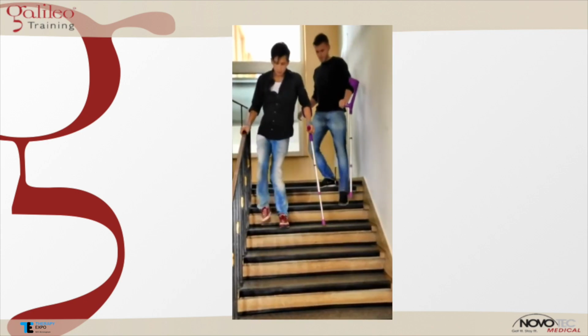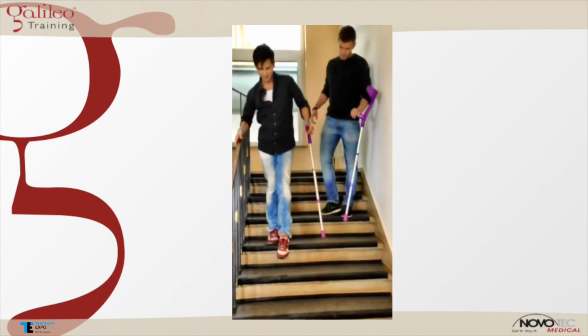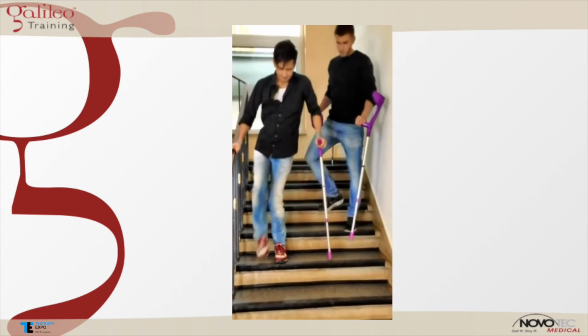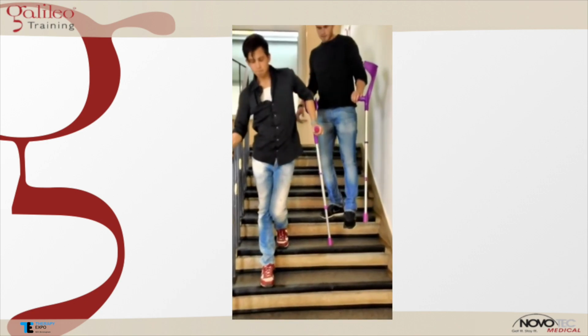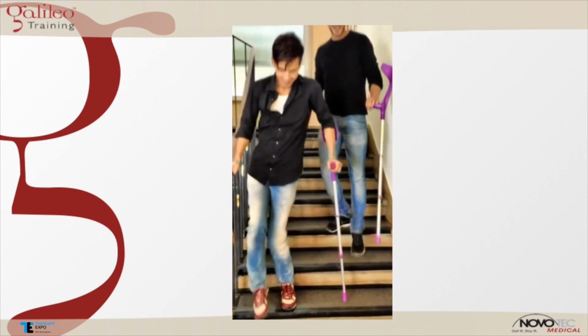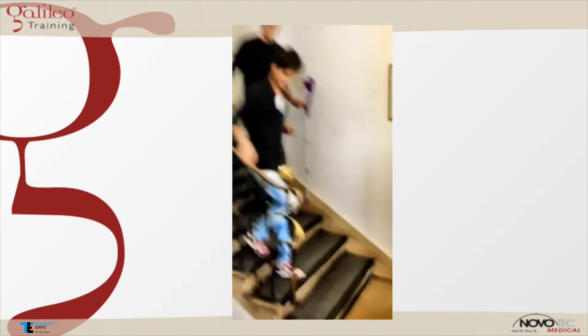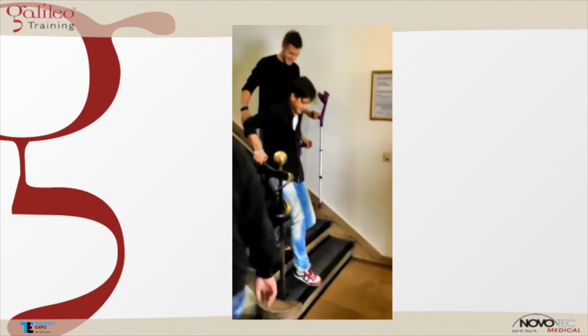And just so that you see what happens, April 2013, in his case, and obviously he was incomplete. With a complete spinal cord injury, it would not work, but he is incomplete, and he has regained the functionality to walk stairs again. So without having a stimulation device and training the neuromuscular system, this would normally not be possible. And now we come to an important topic, Galileo and the frequency, why we have chosen the frequencies.